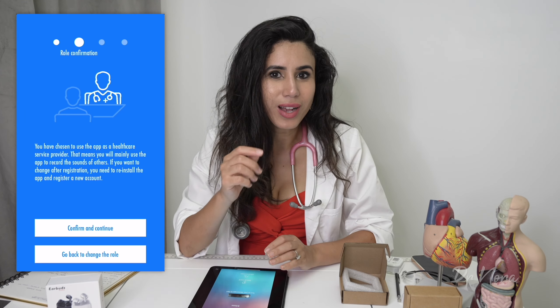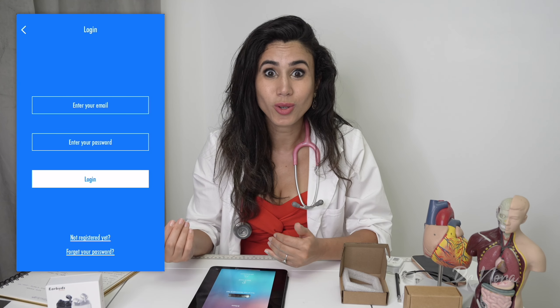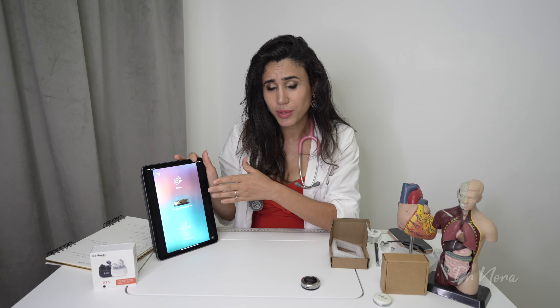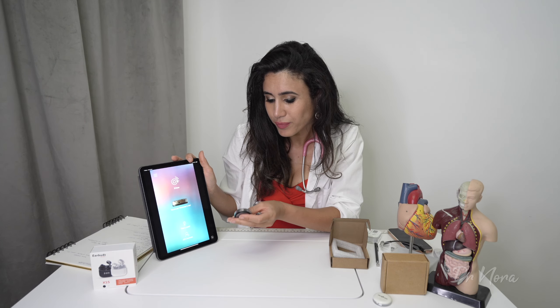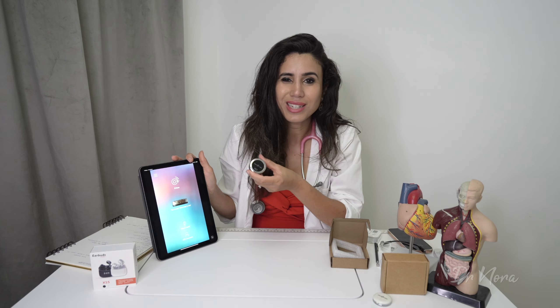I'm using an iPad here. The Stemoscope app has been revamped and is now called Dr. Stemo, which looks a lot nicer. The application is really easy to follow — it tells you exactly what to do. I'll turn it on now, and you can see the light on the Pro indicating it is on.